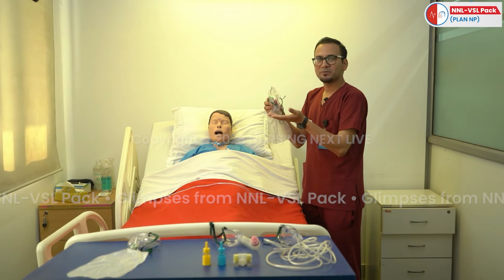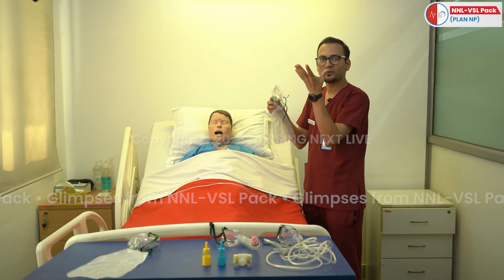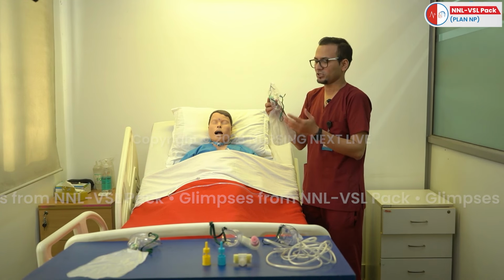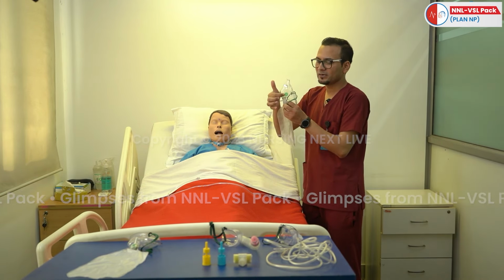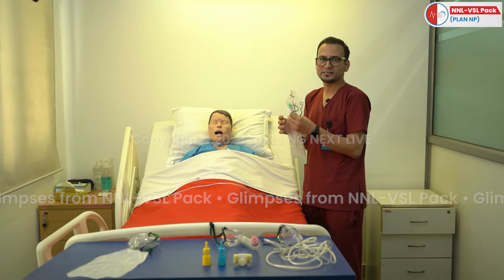The main mechanism behind the opening and closing is that when the person is inhaling the air, the flap will remain open and the person will inhale the exact amount of oxygenation, that means 100% oxygenation. And when the person exhales the air, the flap will remain closed and the carbon dioxide will be released from these pores. So in this there is no significant chance of mixing of air.